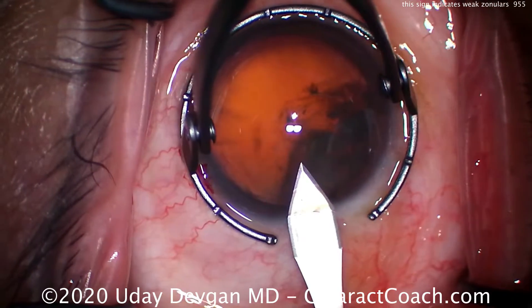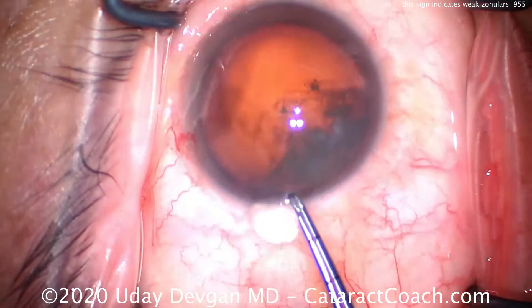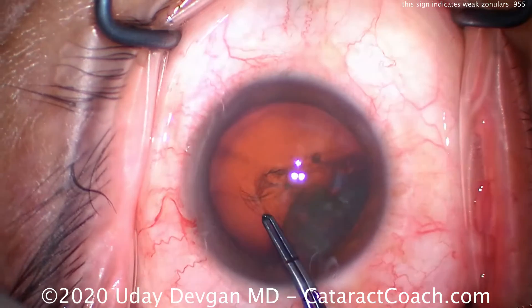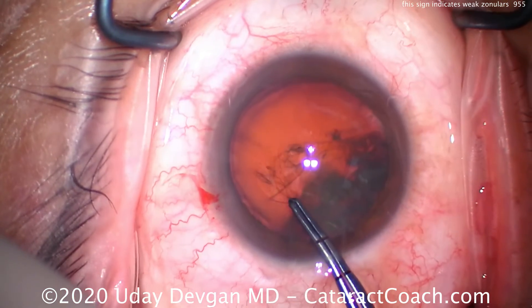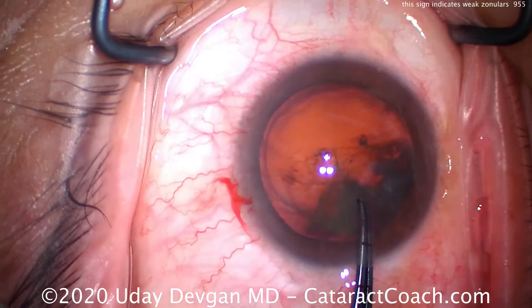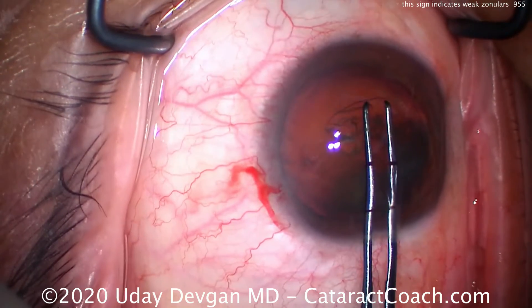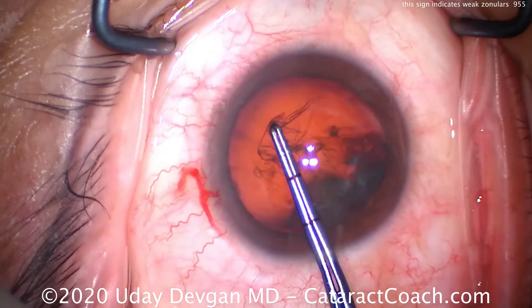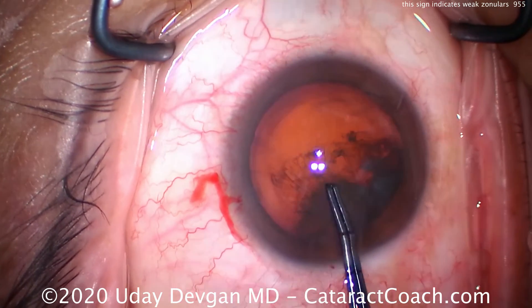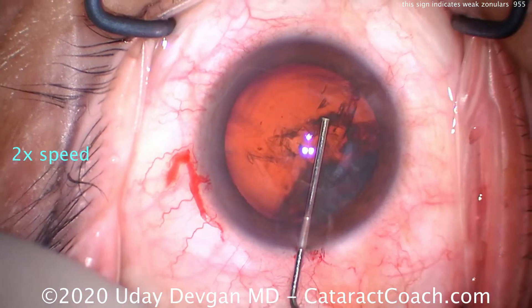As we start the rhexis, which is coming up shortly, you're going to see that subtle sign. Here comes the forceps — we're going to do our rhexis. Look what happens: as we start the rhexis, the nucleus pushes down and the AC deepens a little bit. As we do the rhexis, aqueous comes from underneath the iris and you can see the edge of that viscoelastic-to-aqueous interface. That's the subtle sign — the AC volume increased and deepened while creating the capsular rhexis, meaning weak zonular support.